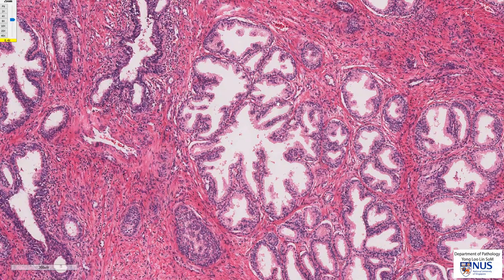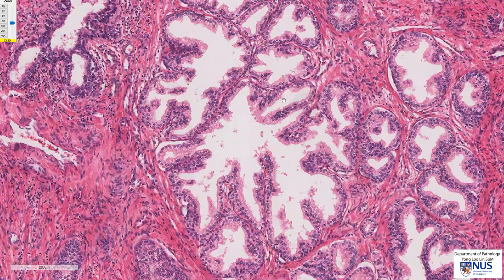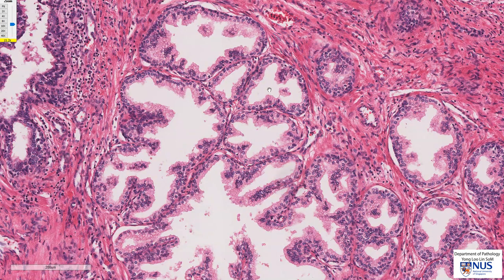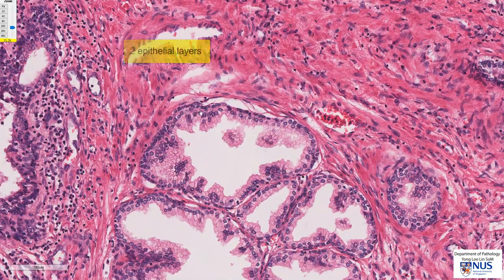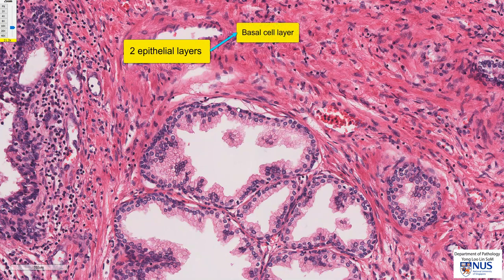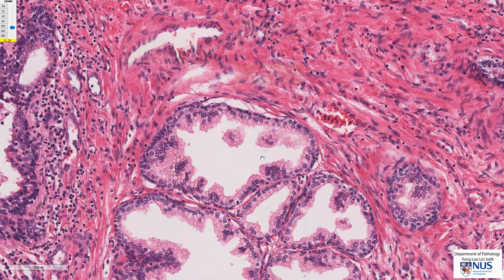If you look at the glands, you'll notice that the benign glands have an interesting feature: the epithelium is actually double layered. We have an outer basal cell layer and an inner luminal cell layer, and this is normal, and it's a good indication that we are dealing with benign prostatic tissue.